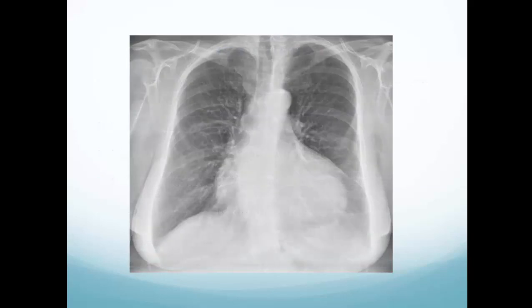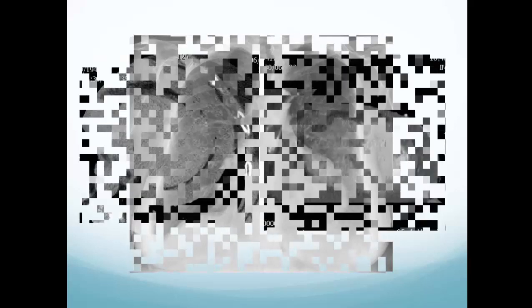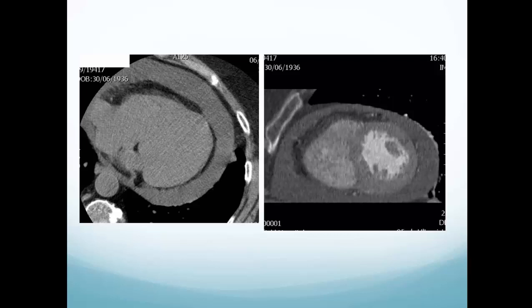On chest X-ray, when the heart is very globular and round — what's called the water bottle sign — you have to think about pericardial effusions. The CT appearance shows the epicardial fat, the right coronary artery running within it, and the two layers of the pericardium split to give rise to a collection. When the effusion is this size, it's easy to distinguish fluid from thickening by placing a region of interest.